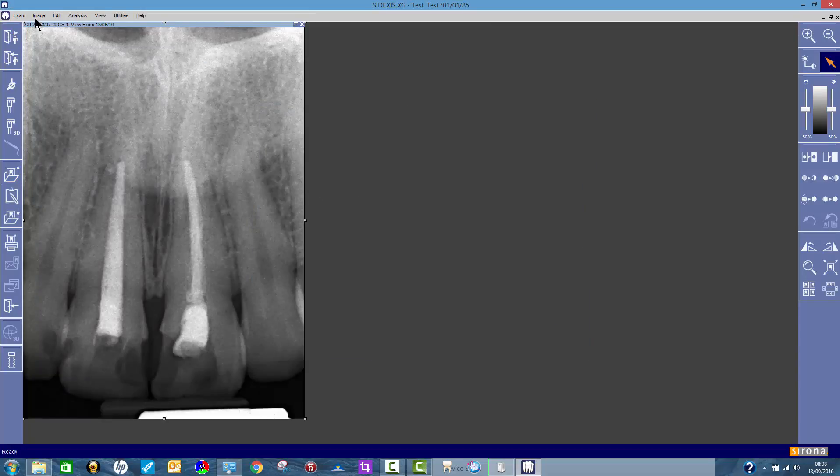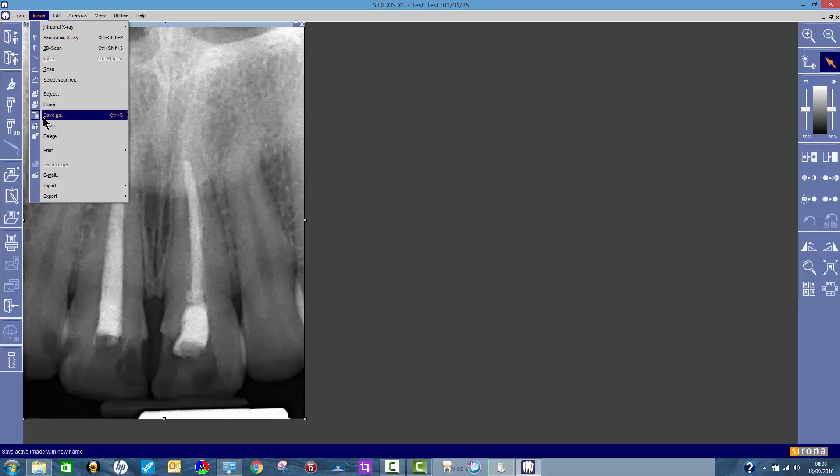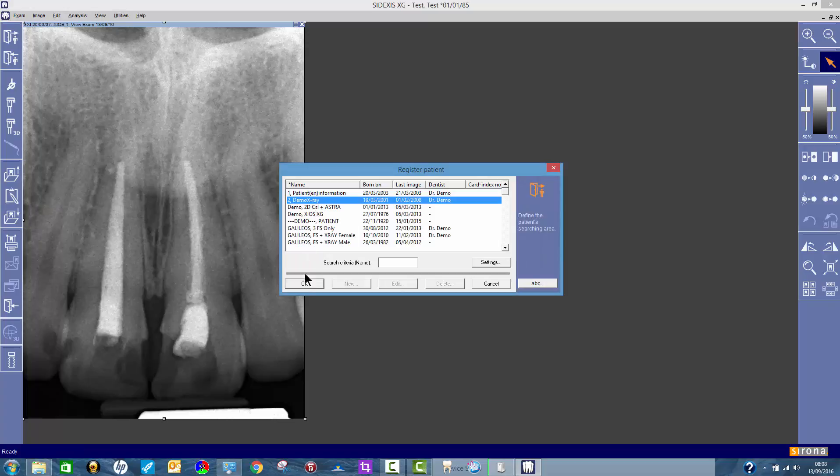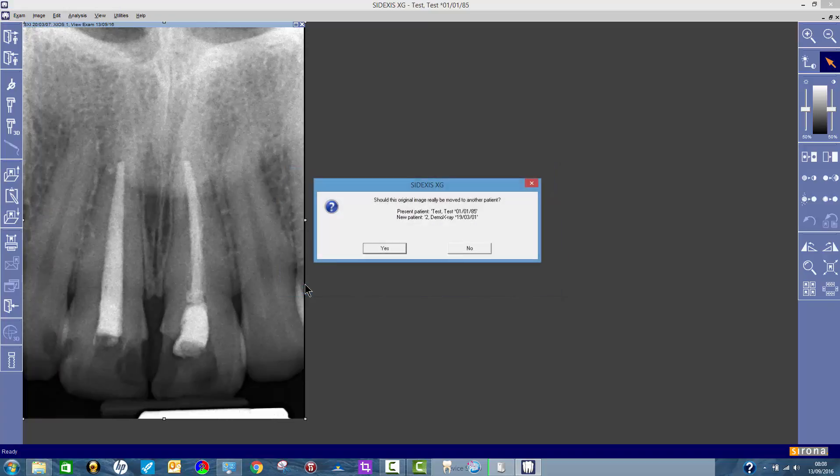Okay, so simple as that. You just click on image, move, and find the one that you want to put it in. So I'm going to put it back in there now. Do I really want to move it from test to demo? Yes I do.